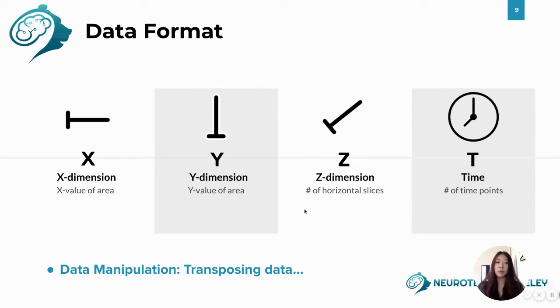But transposing the data is a really important pre-processing step, and it's really simple. All you have to do is implement a method. You can use .transpose or .T, and it'll turn whatever array you give it. If it's XYZT, after you apply the method, it'll give it to you in the reverse shape, in TZYX. This is something we'll look into in the lesson.